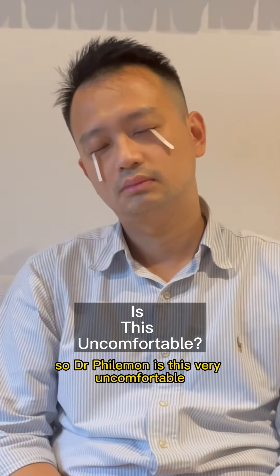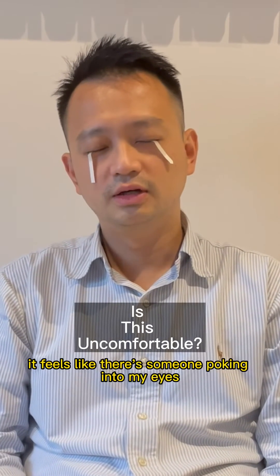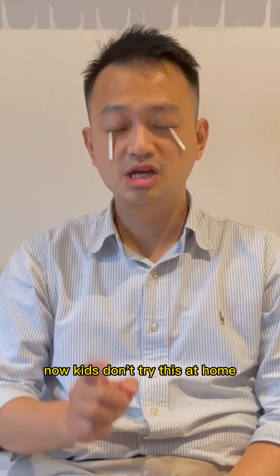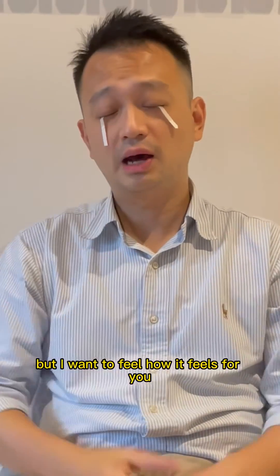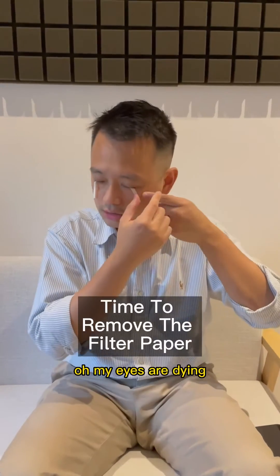So Dr. Fai, is this very uncomfortable? Yes! It is very uncomfortable! It feels like there's someone poking into my eyes. Now kids, don't try this at all — but I want to feel how it feels for you all, that's why I'm doing this. Oh my eyes are dying!